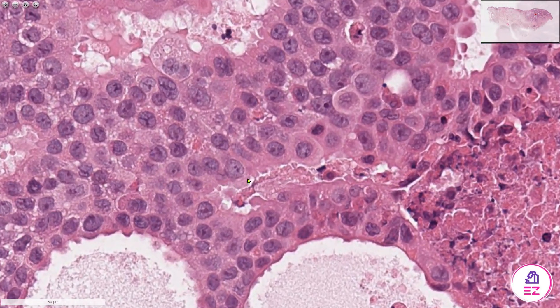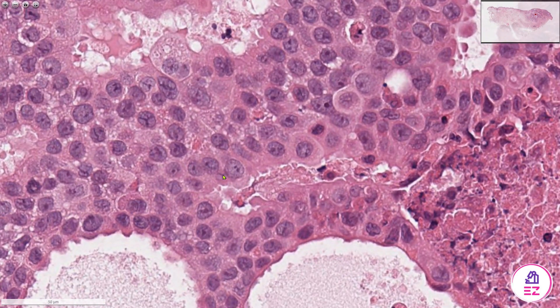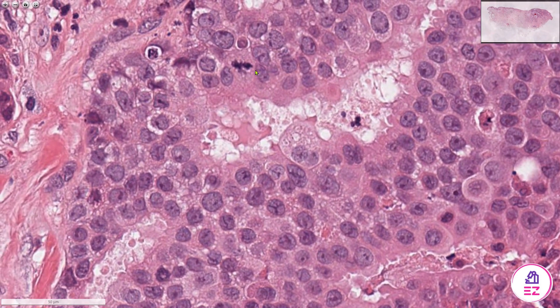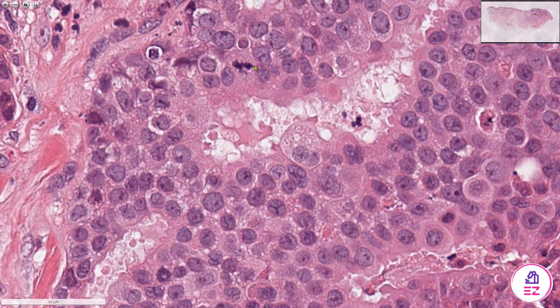The cells making up this tumor have quite ample eosinophilic cytoplasm. There's quite a variation in cell size and nuclear size, so there's some pleomorphism — for instance, there's a huge cell with a very large nucleus compared to others nearby — and we can also see some abnormal mitoses, so it's ticking the boxes for something high grade.